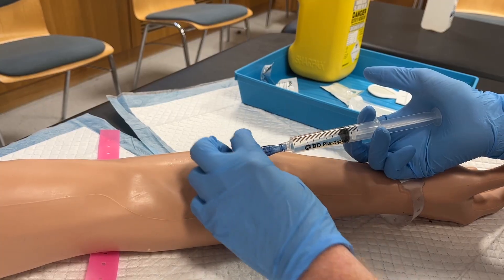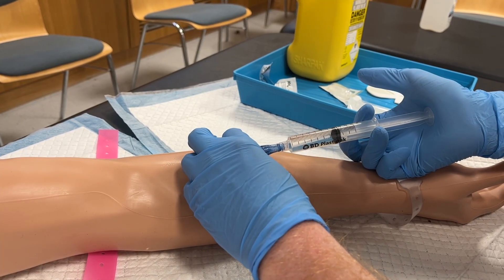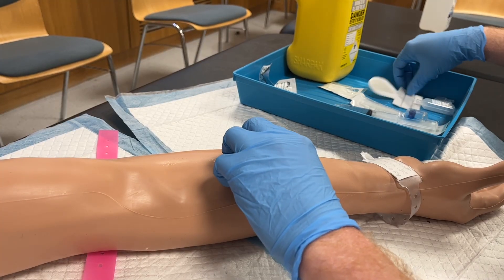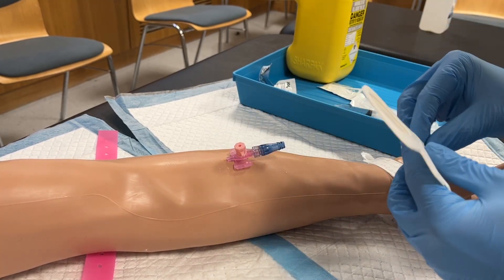Any pain or resistance at this point may indicate that the cannula is not in the vein and should not be used. Once this has been confirmed, the dressing is applied as normal.